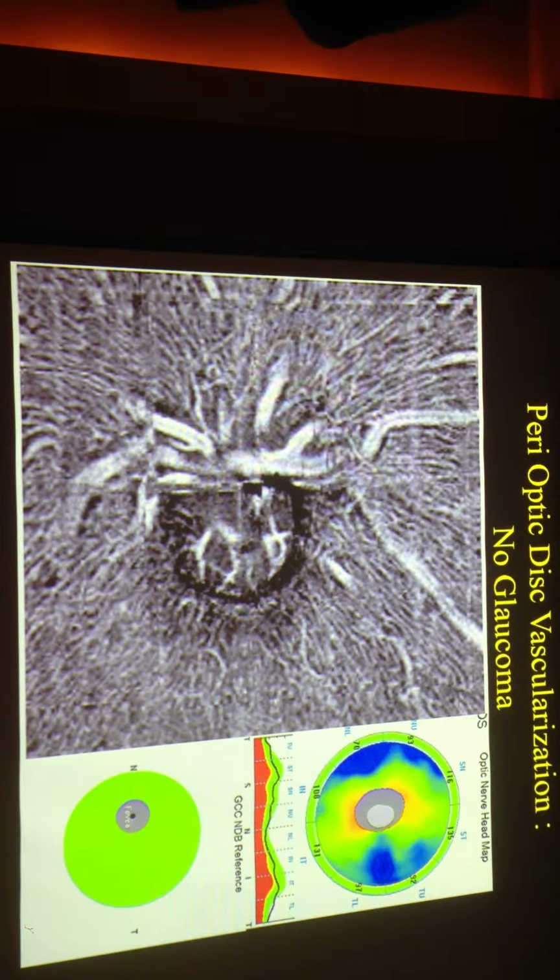And so, as I said to you this morning, we practice a special way of doing ophthalmology because all the patients are referred by ophthalmology doctors. And so when patients are referred to our centers, frequently it's for a checkup for glaucoma. Our conventional observation for glaucoma was to practice visual field, RNFL, and GCC. And so in doing this, we just added another option, which was the OCTA angiography around the disc.